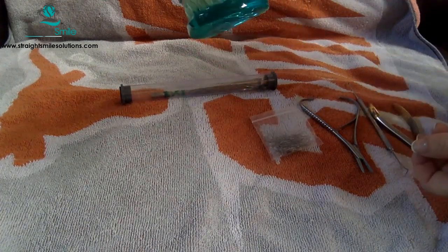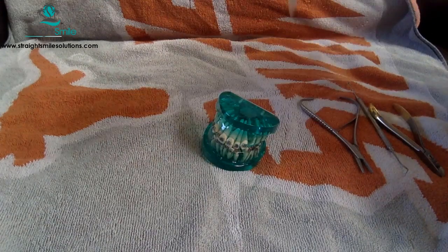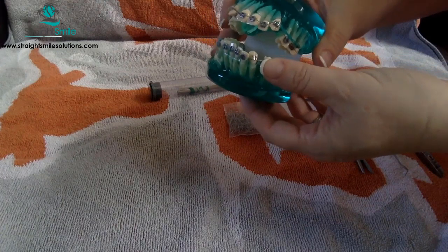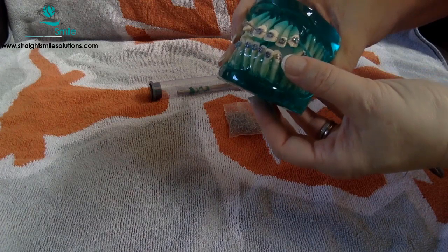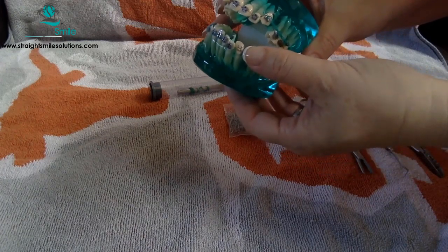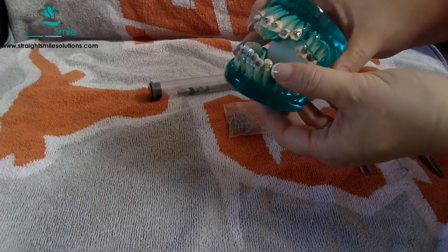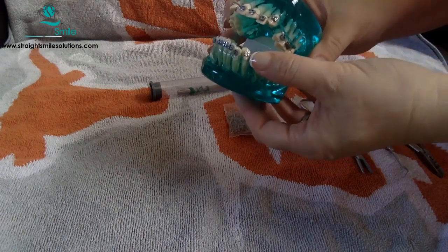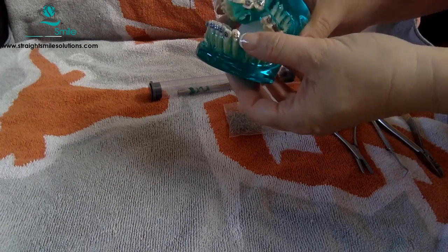So I'll show you how I do it. What we're going to be talking about today is how to engage, let's say you just bonded, and you've got a tooth that's a little bit deflected, and a wire is a little tricky to hold in fully and securely with an elastomeric tie. Or maybe the patient's going away for a couple months and you don't want to have some gross elastomeric ties on. You want it to be more secure. That's why I'd use a stainless steel tie.